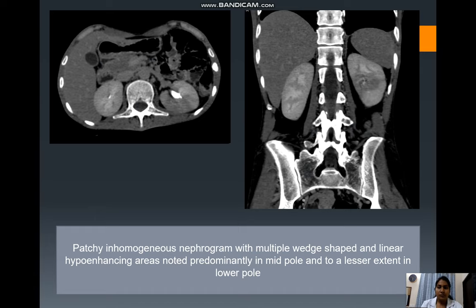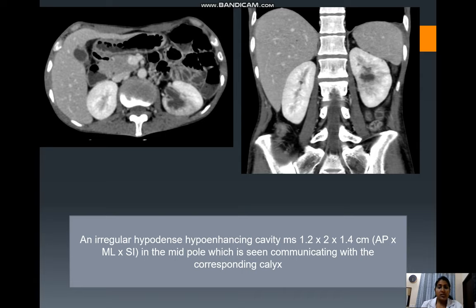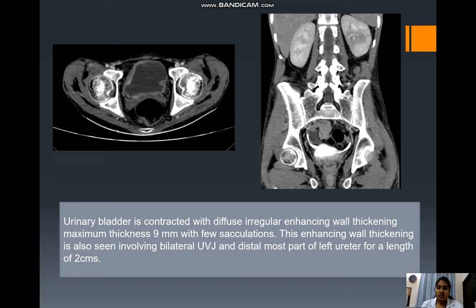The images reveal patchy inhomogeneous nephrogram with multiple wedge-shaped and linear hypo-enhancing areas noted predominantly in the mid-pole and to a lesser extent in the lower pole. Another image reveals an irregular hypodense hypo-enhancing cavity measuring 1.2 cm x 2 cm x 1.4 cm in the mid-pole, seen communicating with the corresponding calyx. This section shows a contracted urinary bladder with diffuse irregular enhancing wall thickening with a maximum thickness of approximately 9 mm, with few sacculations seen within the bladder lumen. This enhancing wall thickening is also seen involving the bilateral vesicoureteric junction and distal most part of the left ureter for a length of approximately 2 cm.